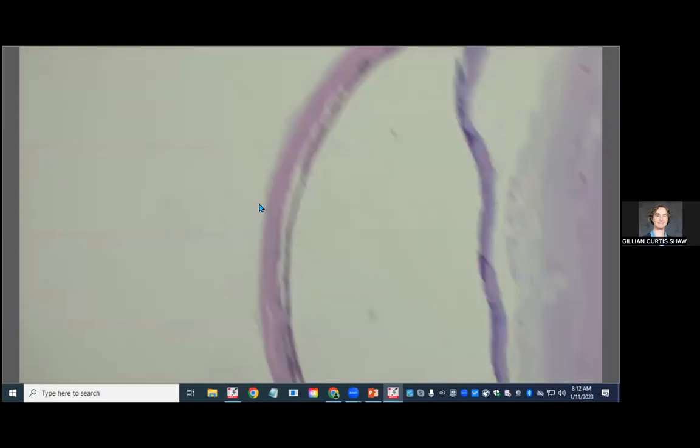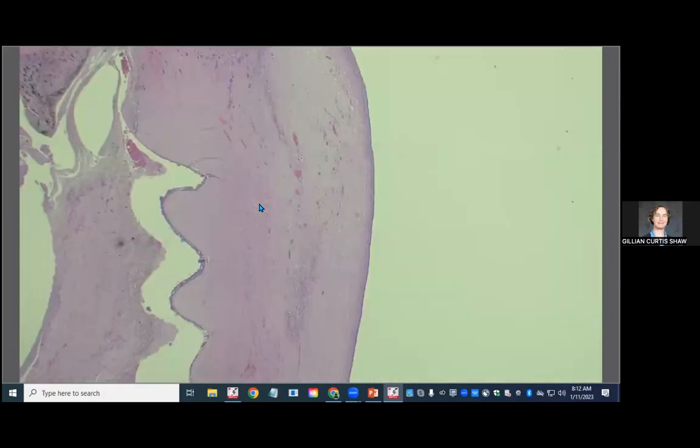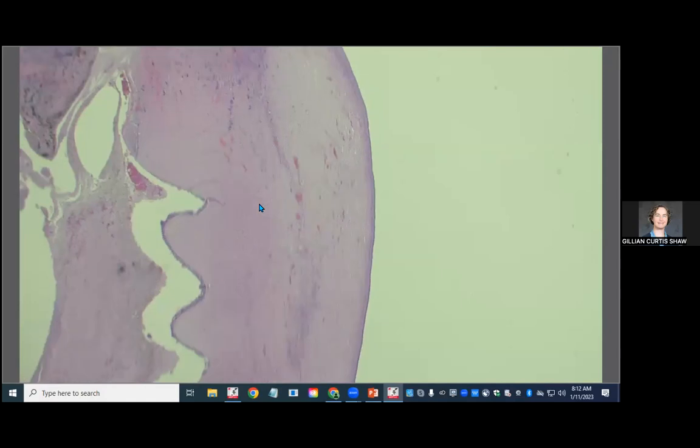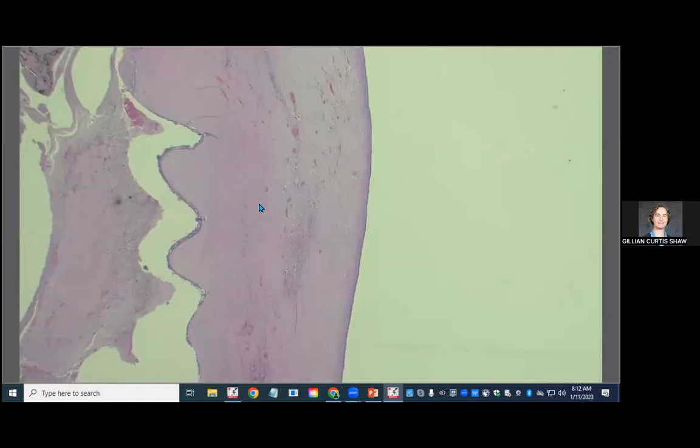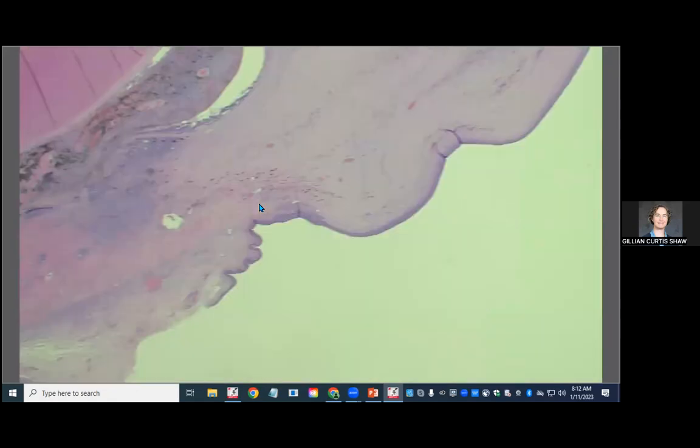This is filthy. Wow, that's a dirty slide. All right. Going to the anterior. So we can see, even from 2X, the corneal disease that they described is pretty impressive. There's a lot of vascularity in here. There's a lot of cellularity. There's a pretty significant keratitis. But what we're interested in is the big hole.